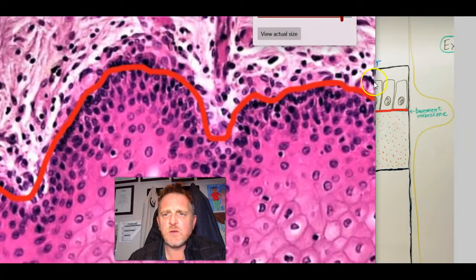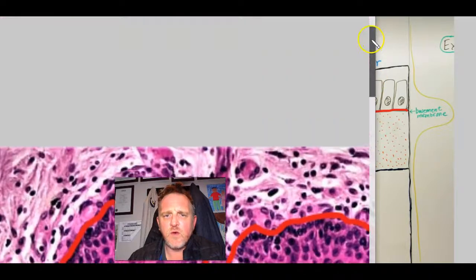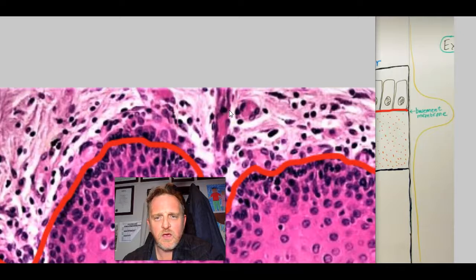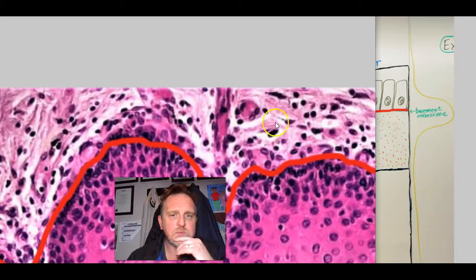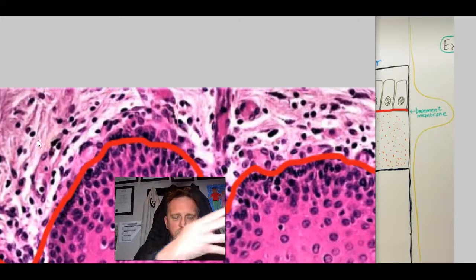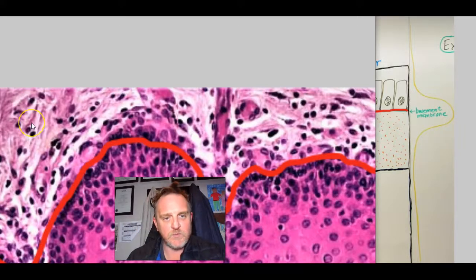Of course, connective tissue, this is where a lot of your immune-based cells are, so defense mechanism. Lymphocytes, macrophages. And a lot of this pink material, which has a fiber-like appearance, stretches across and forms these kind of ribbons. What I'm saying is it connects the epithelium to the submucosa, and it's usually comprised of collagen and a few elastic fibers.